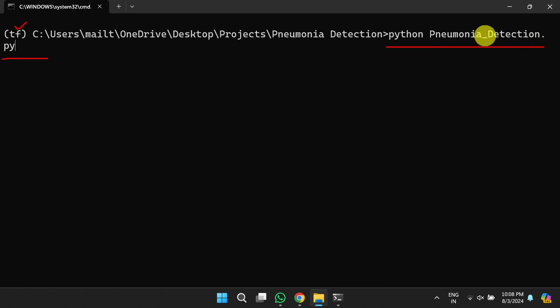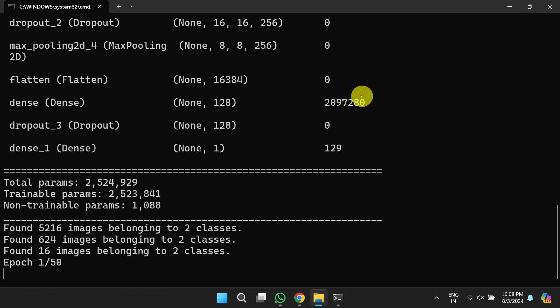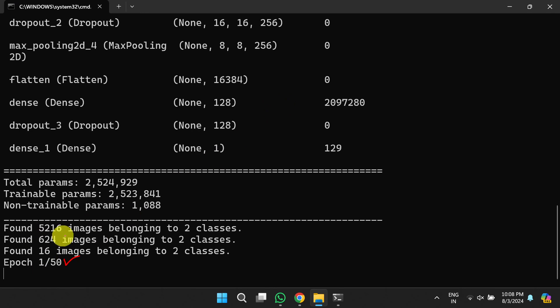Once in the TensorFlow environment, run the command 'python pneumonia_code_detection.py'. This will start executing the source code and will run for 50 epochs. You can observe the total trainable parameters and non-trainable parameters for the model. Once it executes for 50 epochs, the model will be saved into the models directory, and you can use that model for classifying new images using the Flask app — the procedure for which was already shown.